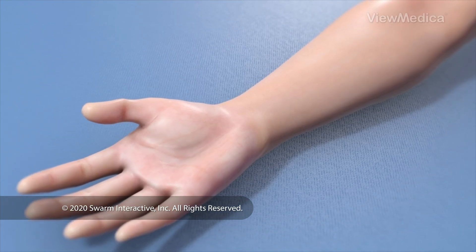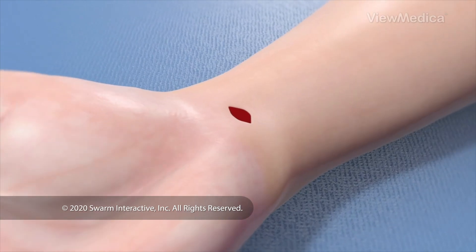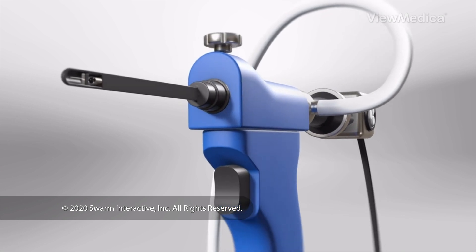To begin, your wrist and hand are numbed. The surgeon makes one or more openings in your skin for a video camera device called an endoscope and tiny surgical instruments.